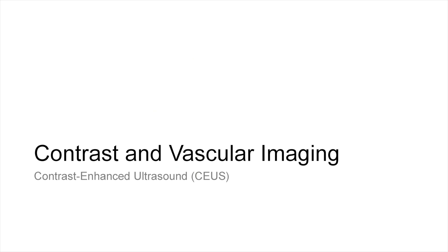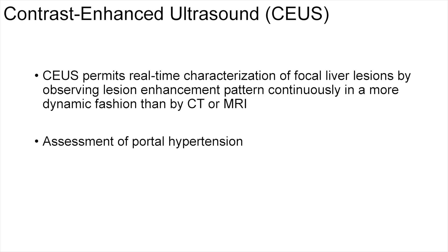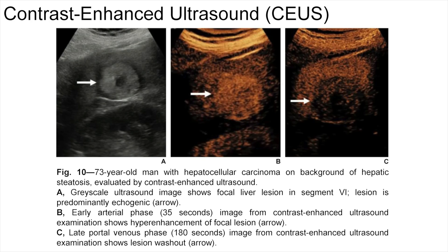Contrast vascular imaging can be performed with contrast-enhanced ultrasound, or CEUS. This technique permits real-time characterization of focal liver lesions by observing lesion enhancement pattern continuously in a more dynamic fashion than by CT or MRI. It can also be used to assess portal hypertension. In this example, a 63-year-old man with hepatocellular carcinoma is seen on the background of hepatic steatosis as evaluated by CEUS. The grayscale image shows a focal liver lesion in segment 6, which is predominantly echogenic. The arterial early phase image shows hyperenhancement of this mass, and the portal venous phase shows lesion washout.